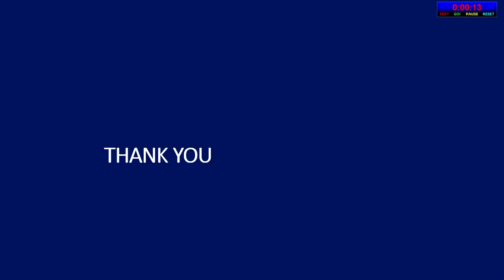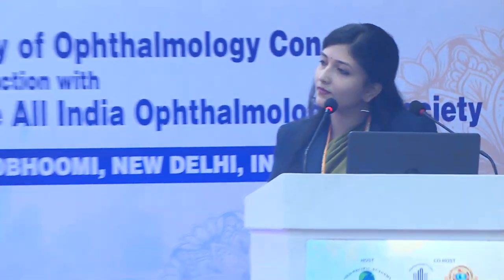Nice paper, because it's very important. There's a very important point she's brought out, that if all of us start measuring the vault size, we will understand that there is some variation occurring, because there are variations in the white to white measurement done by the technician, which is why UBM measurements have started gaining greater footing, although we don't have those advanced machines in our country.